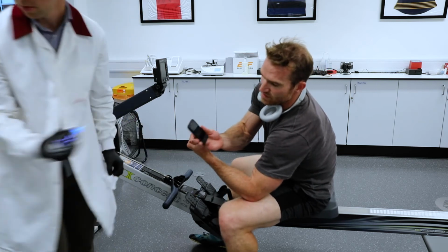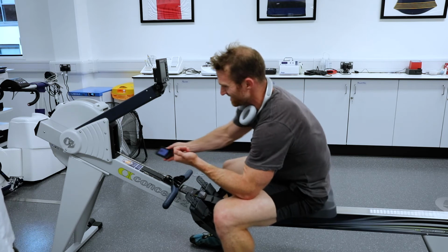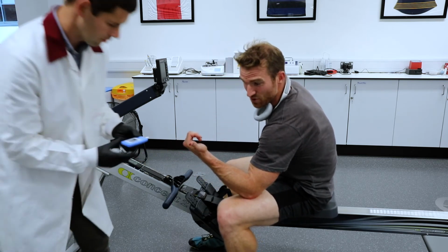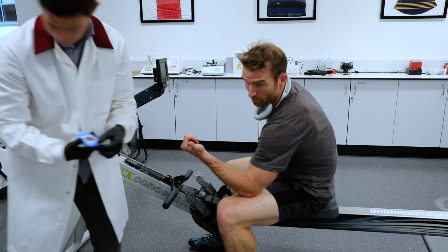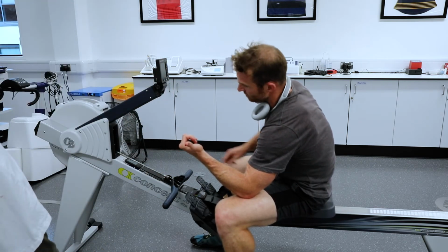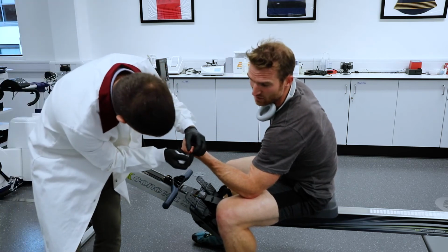7.1. 7.1. So obviously that glucose that I'd had, that 24 grams, has really kicked in now. And again, when the glucose is moving rapidly, because I've just had 24 grams of pure glucose, the blood level is always going to rise quicker than the CGM. So what we'll see shortly is the CGM values catching up, and they'll be up in the 5s and 6s with the arrow trending up.